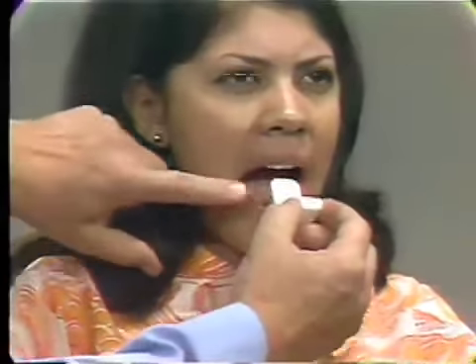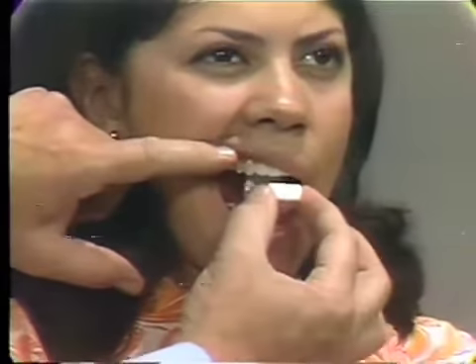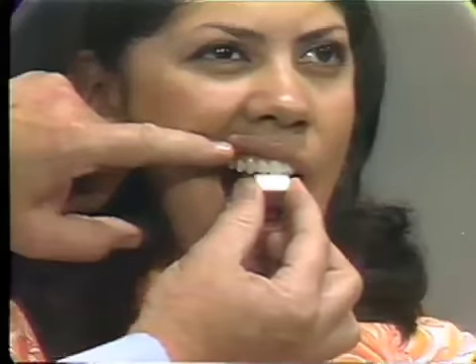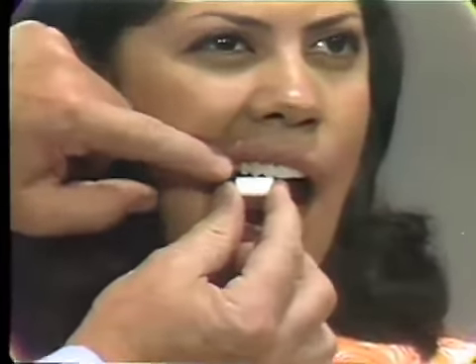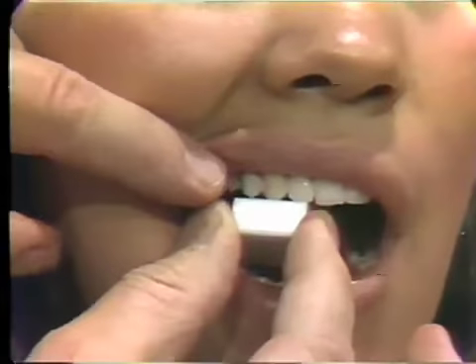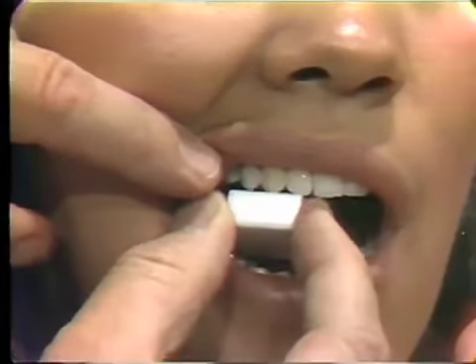Now we turn to our patient, again using the number 0 film in the bite block. Grasping the film between thumb and forefinger, we insert the film in the mouth just as though we're going to do centrals once again, and then rotate around the corner until finally we've come to rest with the cuspid in the center of the block. Now gently close.